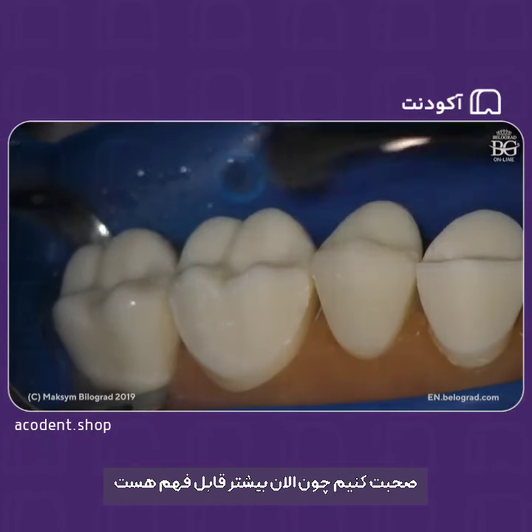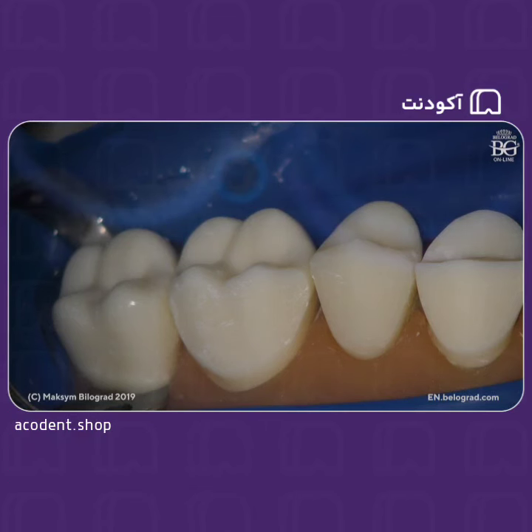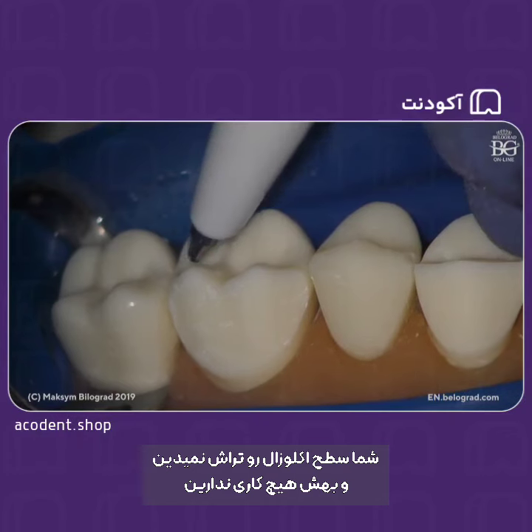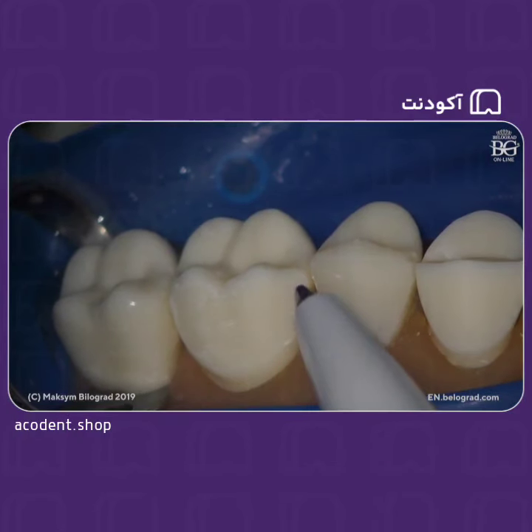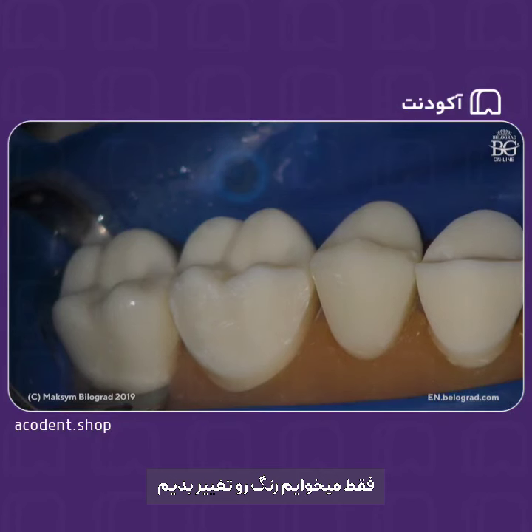Now it's more or less understandable and we can discuss. So, window prep. Window prep is when you are not preparing the occlusal surface. You don't do anything on the occlusal surface. You just prep the buccal surface, and this type of preparation is indicated when you are just changing color.